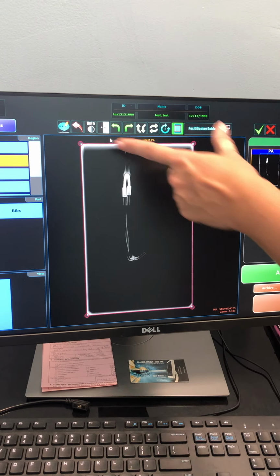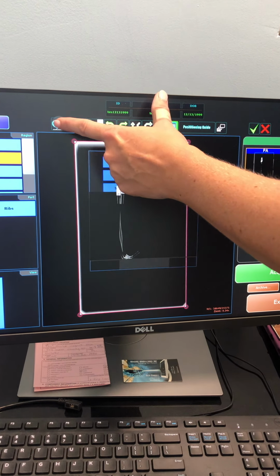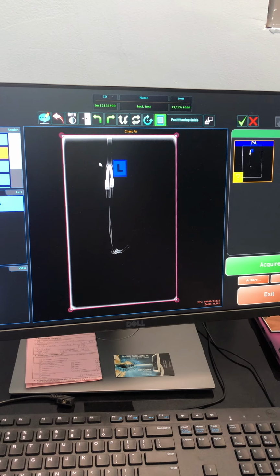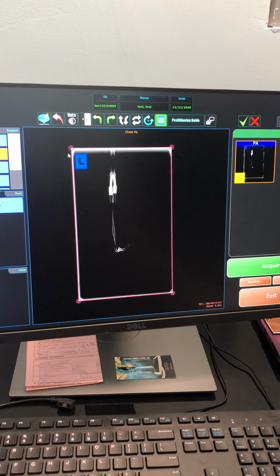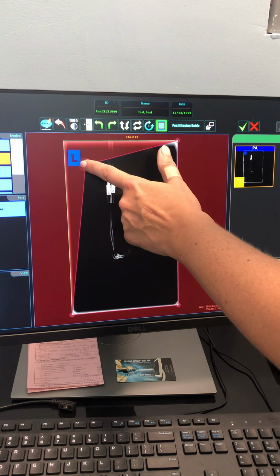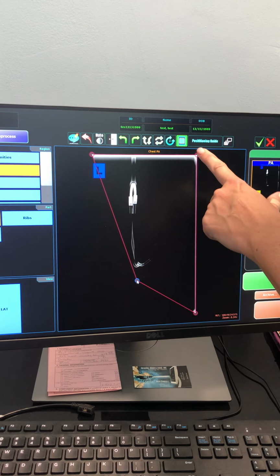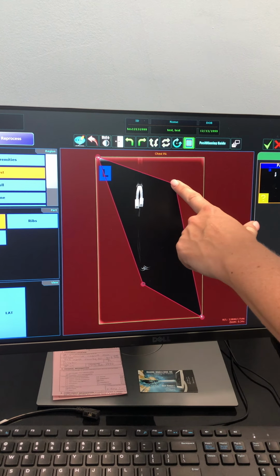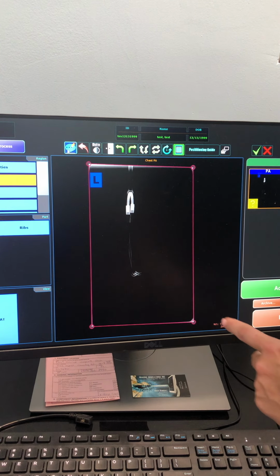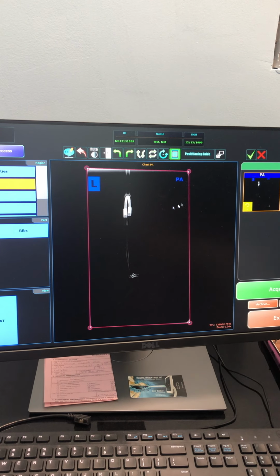indicate left and right, all of our settings, hold on, is it here? No, there we go. So we got our left, and we're gonna go ahead and click and drag it, and you can make it, pretty sure you can make it bigger. Nope, okay. So let's say there's something that we don't want in the image, you can bring it on in like this, but that's just getting too fancy. Okay, so left, and then let's say it's a PA, sure. Go ahead and put it there.